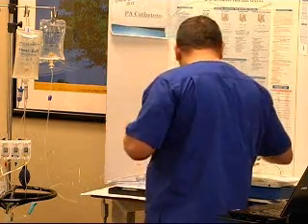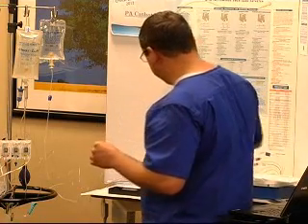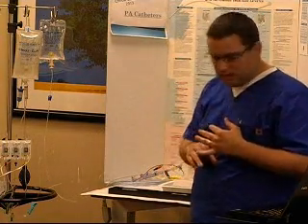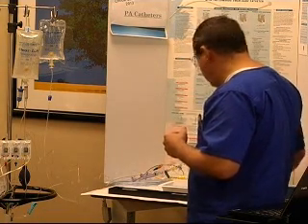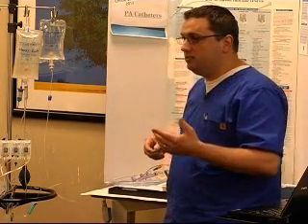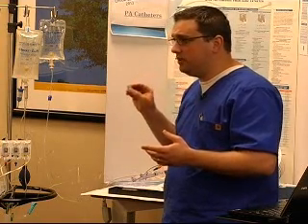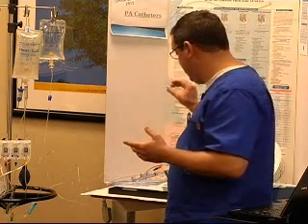So one other thing to talk about is the PA catheter removal. Now, PA catheter removal, there's a couple things to remember about this. One, like I was saying, there's an obturator cap. So if you're going to be taking it out, one of the questions you might have for the physician is, are we going to keep the introducer? Because these are great central lines for volume resuscitation because it's a very large catheter. And make sure that you have an obturator kit if you're going to keep that catheter in place.